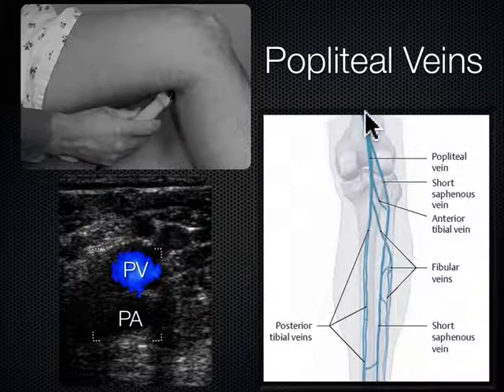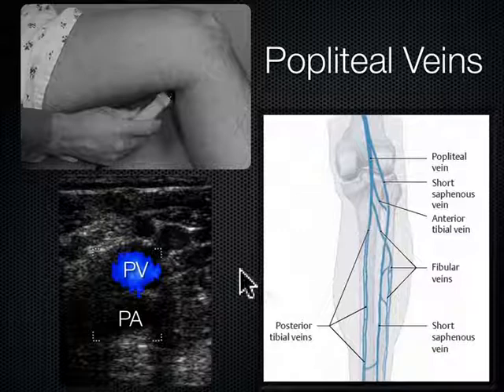And in that popliteal fossa, what's happening is the popliteal vein comes down and then it bifurcates and trifurcates, and it's so furcated down here that it's such a small caliber down here in the calf that we don't really care about it too much anymore. Diagnostically speaking, those small caliber calf veins, even if they do have a clot, we don't treat them anymore. So it does put them at risk for progression to a more proximal clot someday. So they do come back for repeat scans, but we're really concerned with this popliteal region.